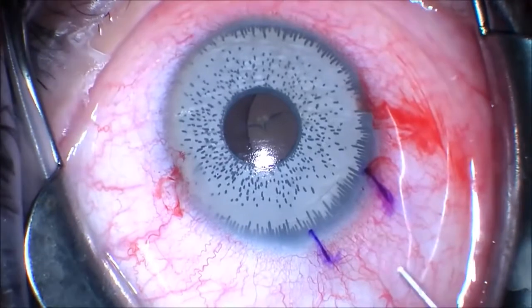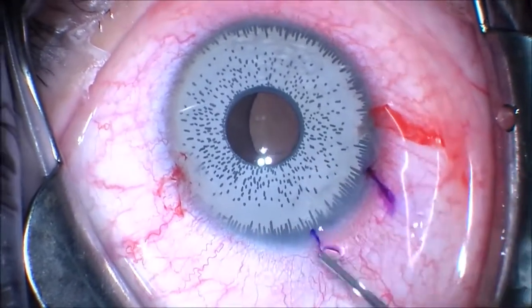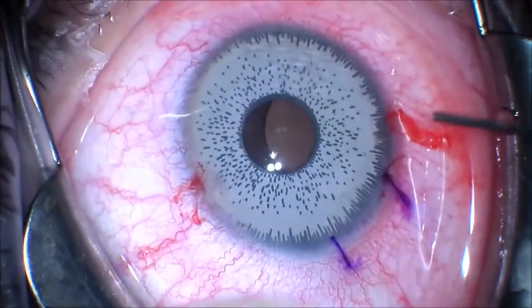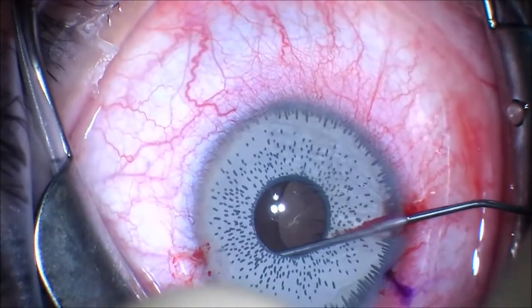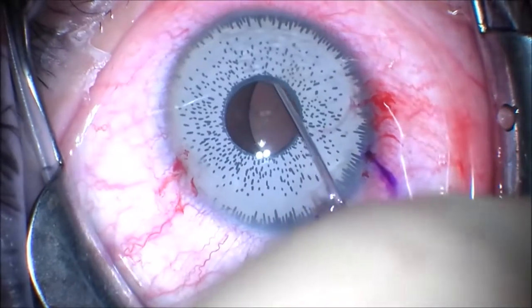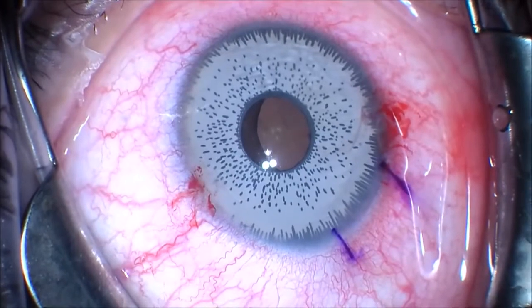Next, we're going to dissect underneath the iris implant with a dispersive viscoelastic to keep the natural lens and iris away from the prosthetic iris implant. We also want to place viscoelastic underneath the corneal dome to protect the corneal endothelium. And we're going to come in from both the superior and inferior paracentesis incisions to maximally viscodissect underneath the prosthetic. I've edited this video and not shown all the viscodissection to make the length appropriate for teaching purposes.